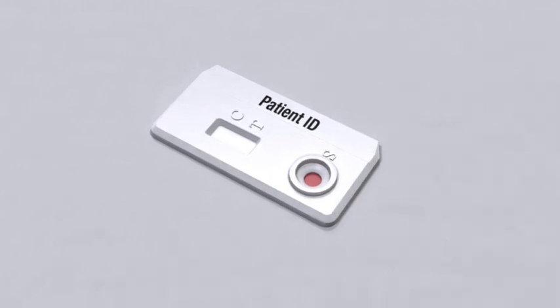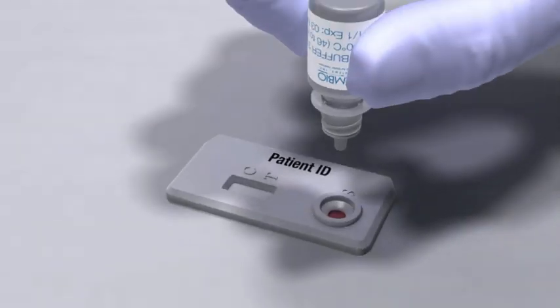Invert the running buffer bottle and hold it vertically, not at an angle, over the sample well. Add 3 drops of buffer slowly, drop by drop, into the sample well.